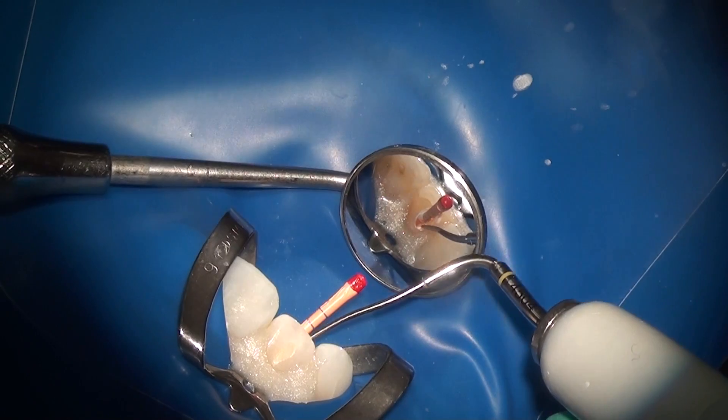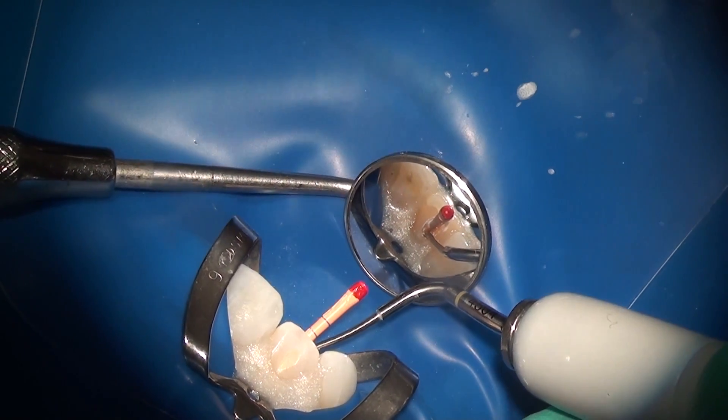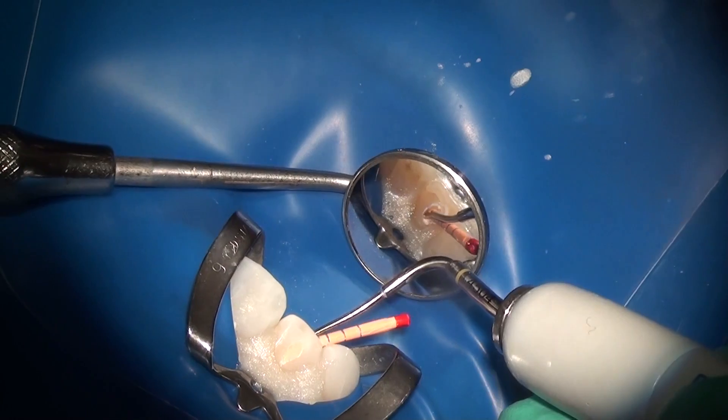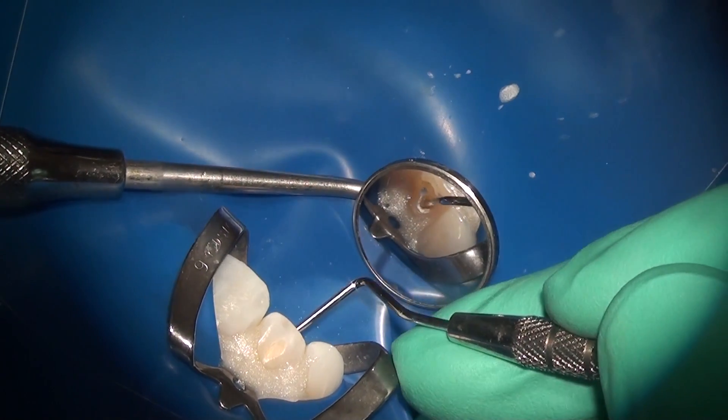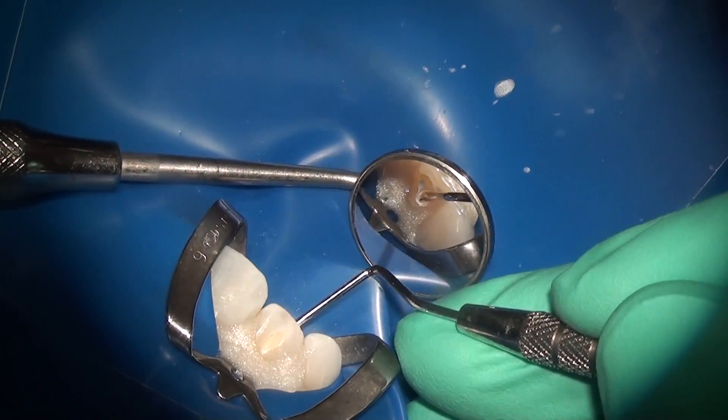After the cones are seated, you sear the gutta percha at the orifice level using a high-energy heat source such as the EndoPro 270, a Touch 'n Heat, or a System B. I prefer the EndoPro 270 because the EndoSequence gutta percha cone is of higher molecular density and you want to reach the highest level of heat to sear off very smoothly. Then you proceed to condense the gutta percha at the level of the orifice using a condenser.